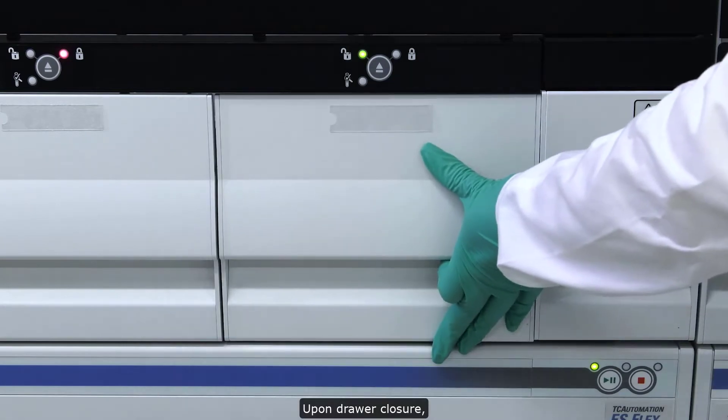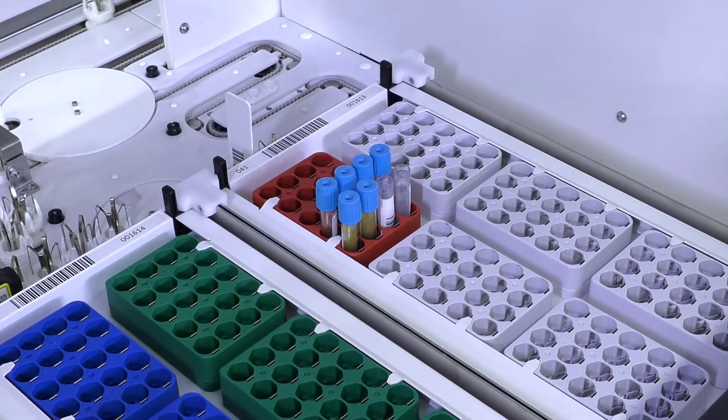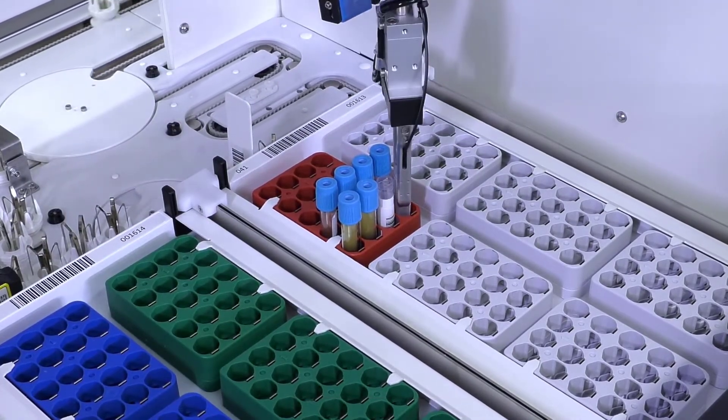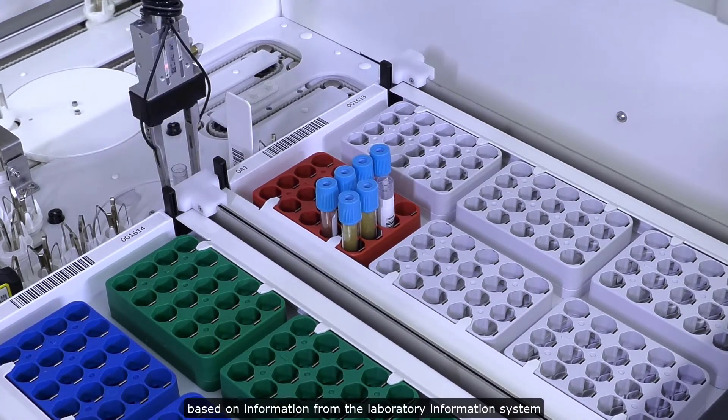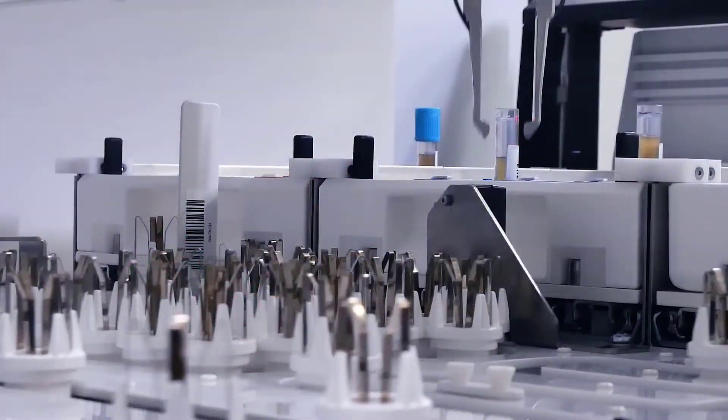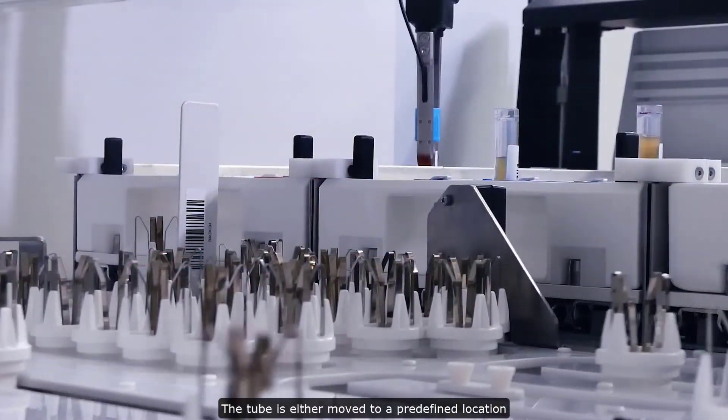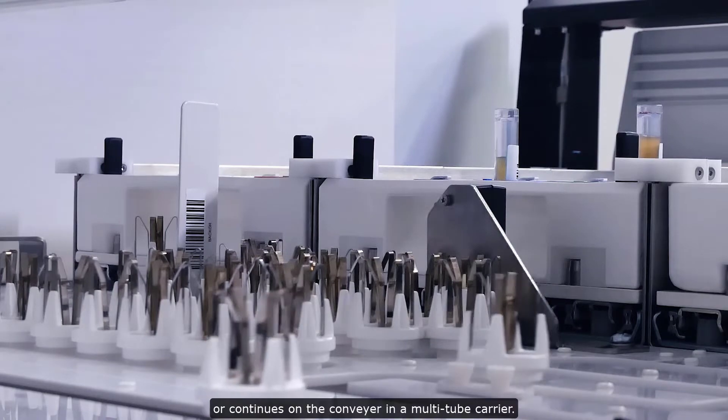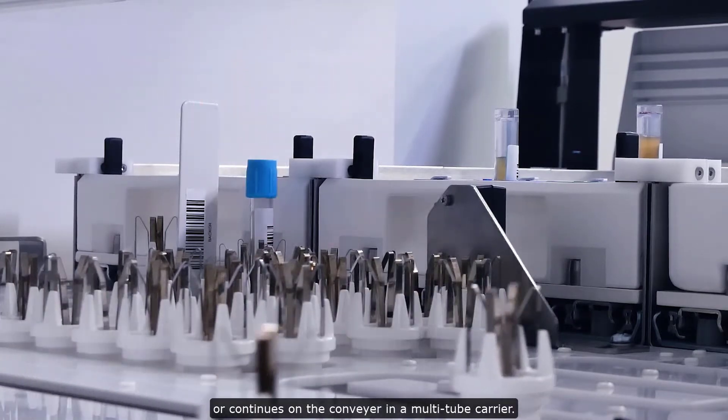Upon drawer closure, the arm unloads samples from racks into a multi-tube carrier, scanning the barcode and assigning the route based on information from the laboratory information system and HemoHub. The tube is either moved to a predefined location for sorting and storage, or continues on the conveyor in a multi-tube carrier.